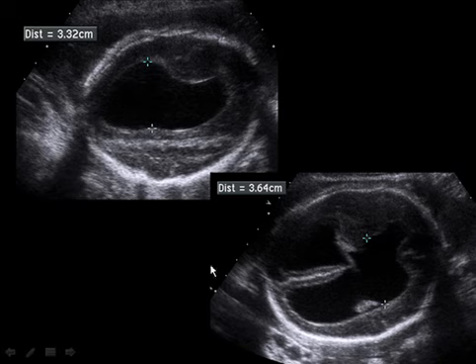Well, why does it matter? Here's an example of a fetus where we were measuring both right and left ventricles, and clearly there's hydrocephalus. There's no question that these ventricles are dilated. But if you notice on this up ventricle, the measurement is 33 millimeters, but here's the falx. The presence of the falx in the back third of the head tells me that we're oblique through the head. The falx should be running right down the middle. So we have artificially increased the size of this lateral ventricle.